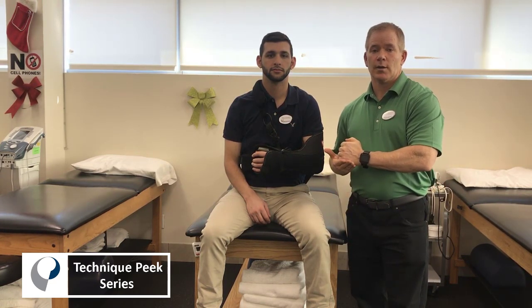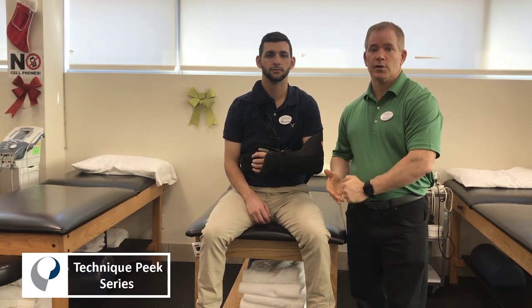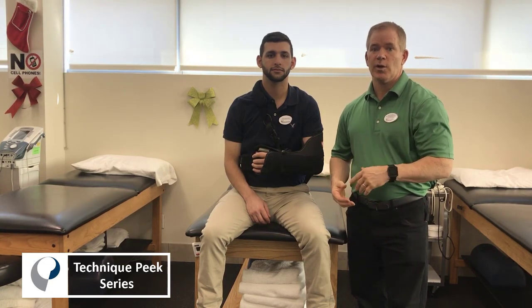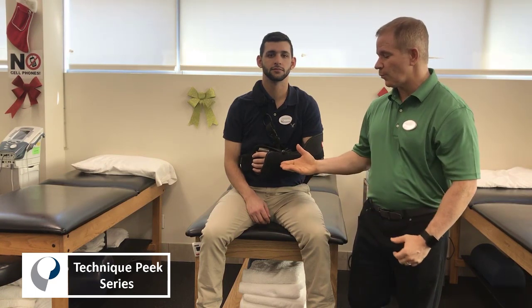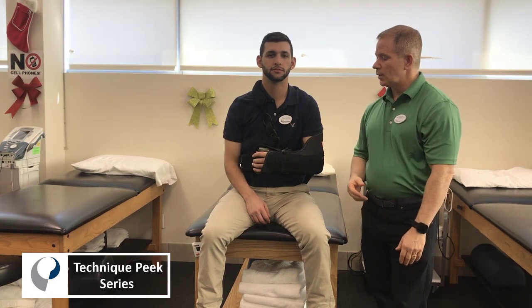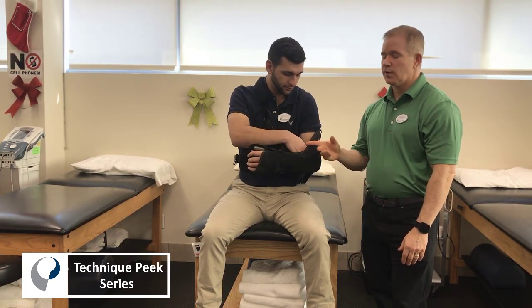The hand should be a little bit higher than the elbow ideally, but certainly no lower. We don't want the hand to be below the elbow, which we often see when patients come in with the sling improperly positioned. This is the proper position. The next step is to unlock the chest strap.